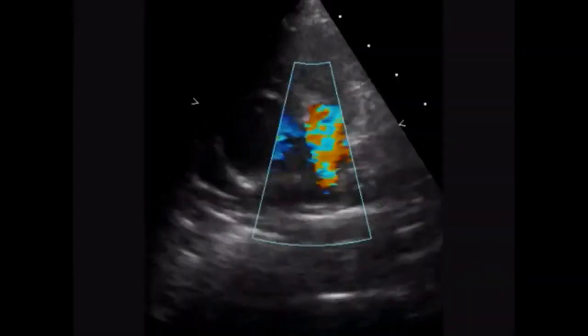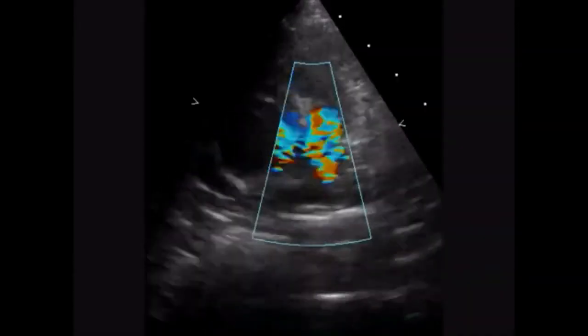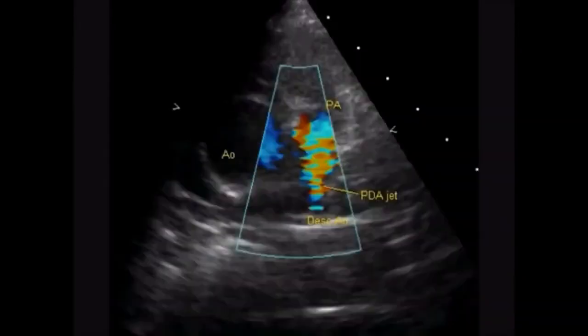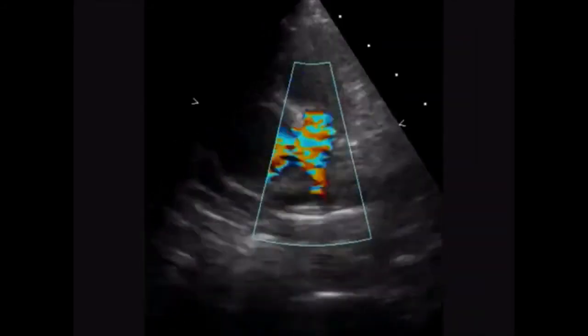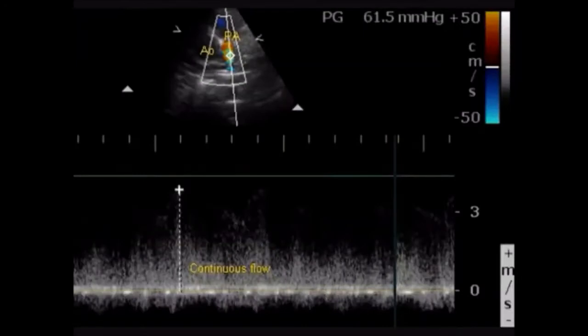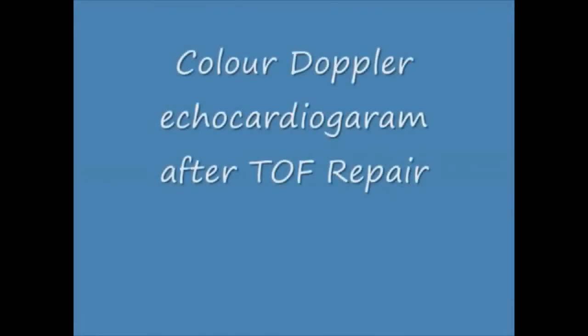This is the patent ductus arteriosus in a case of tetralogy of Fallot — it is away from the transducer. You can see the flow into the pulmonary artery, which is a continuous flow. This is the CW Doppler, continuous wave Doppler, of the PDA jet.